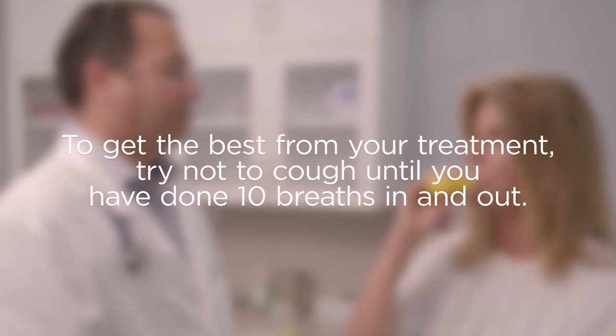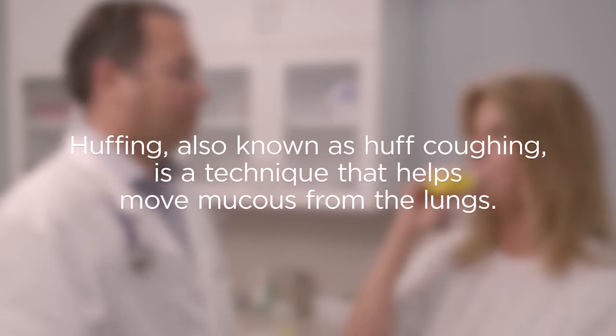To get the best from your treatment, try not to cough until you have done 10 breaths in and out. Huffing, also known as huff coughing, is a technique that helps move mucus from the lungs.